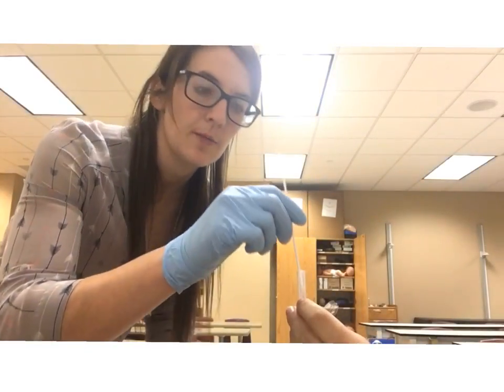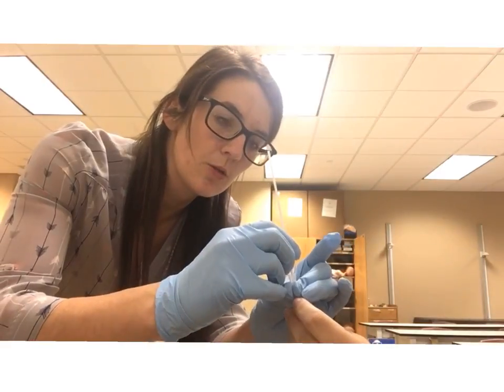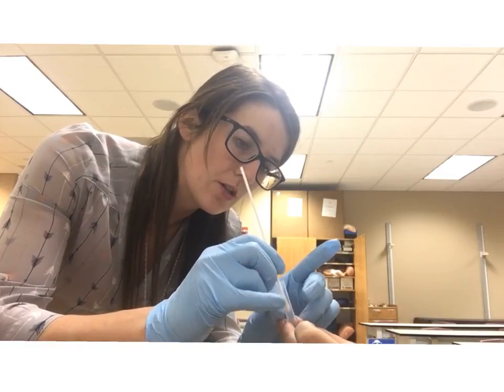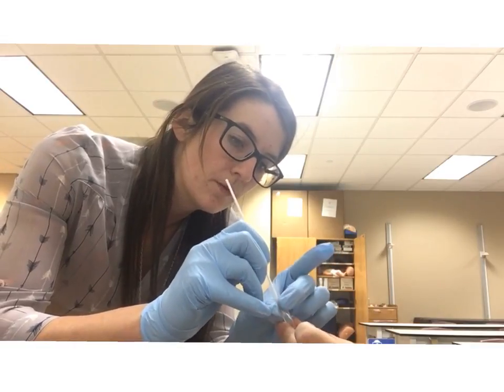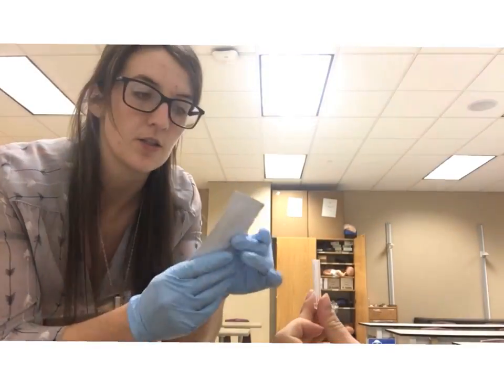After it's sat for one to two minutes, take the cotton swab out of the tube. Use the side of the tube to squish all of the remaining fluid out of the cotton swab to make sure we get as much as we can. Next, take the test strip and open the package.